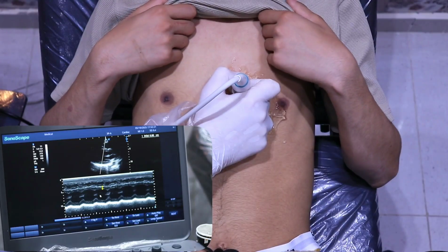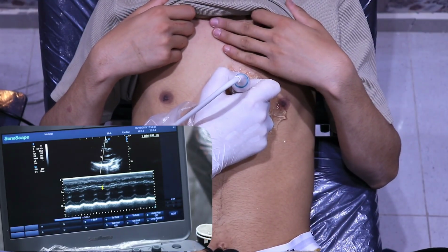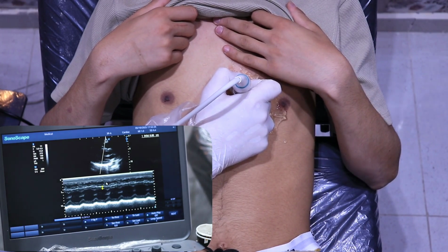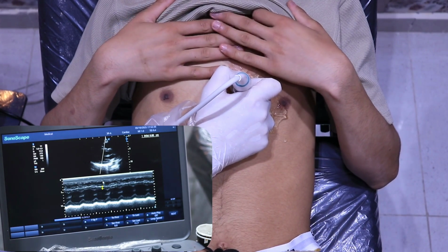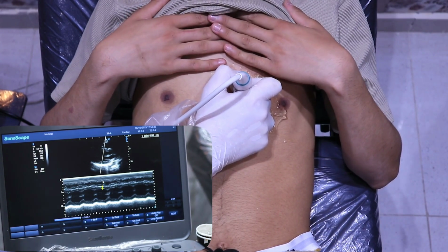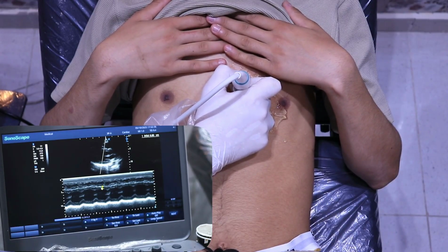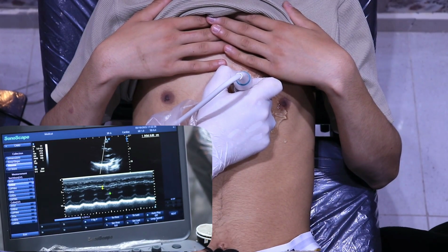طيب وده ايه؟ ده المودريتور باند اهو فوق اهو شايف حضرتك. This is the moderator band of the RV. اهو ده ال RV فوق. Okay? Are you convinced? All right. So let's go back and measure. So these are the measurements of the septum.